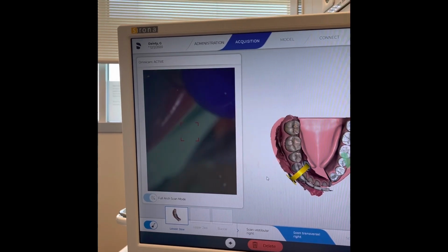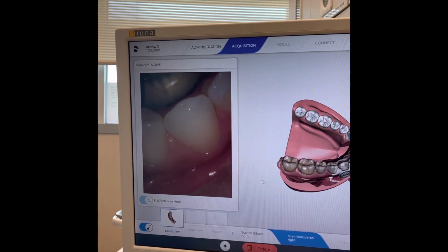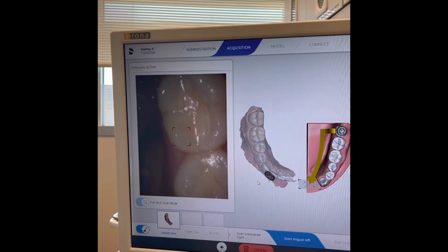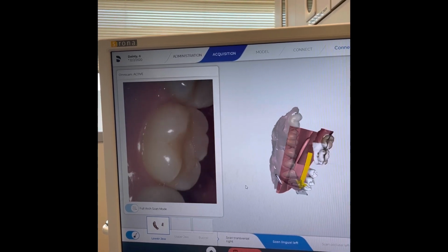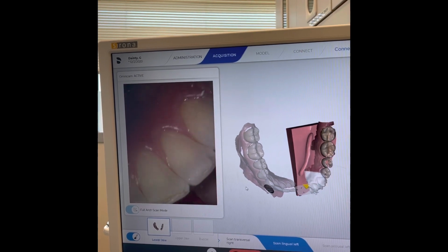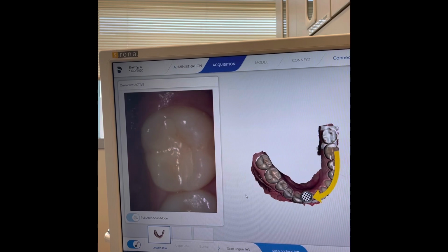Okay, now we're getting our canine roll. Okay, perfect. We got that side right there. Same thing over here. And I'm sorry, this is torturing you, Dr. Dainty. This thing's pretty slick, Dr. Hanson. Yeah, I think they were good. Okay, stitch our images together there so everything looks good.